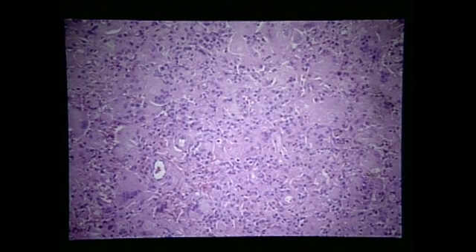This was a case of nasal amyloidosis being characterized by a very dry, dense, what at first sight looks like inflammatory infiltrate, but these areas are amorphic, pink areas, when specially stained and subjected to Congo red, showed evidence of amyloid. There is a cellular reaction to the presence of amyloid characterized by multinucleated giant cells and some plasma cells. A case of cutaneous amyloidosis being associated with alopecia. It's depicted in this horse.